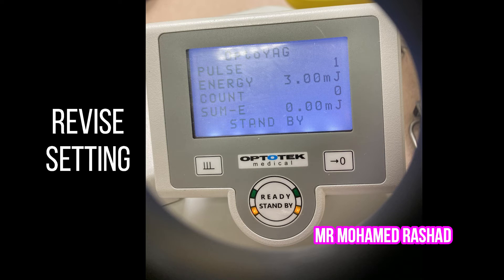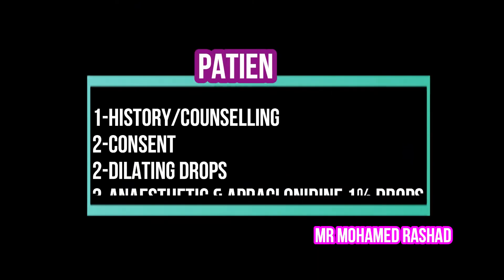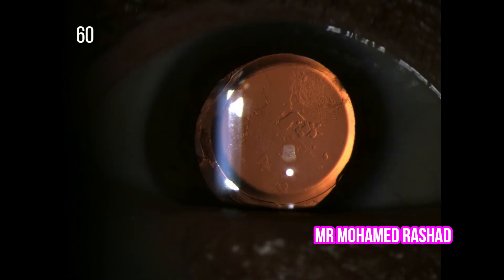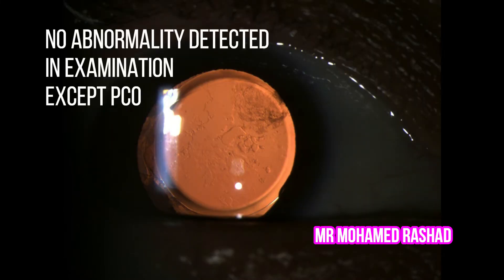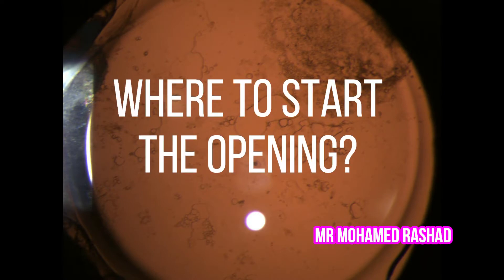When the patient has had cataract surgery, the risks include: the most common being floaters, and the most serious being cystoid macular edema. Apply dilating drops, anaesthetic drops, and apraclonidine to control the pressure. The patient presents with a drop in vision and no other abnormality except posterior capsule opacification (PCO).